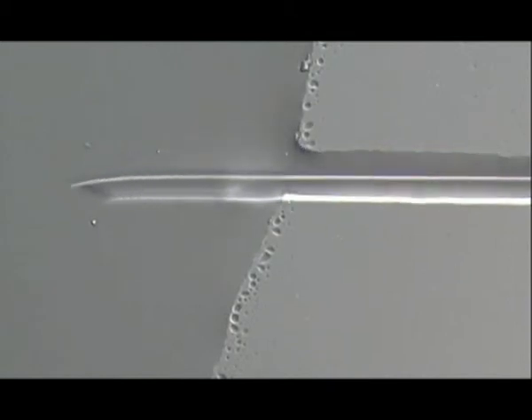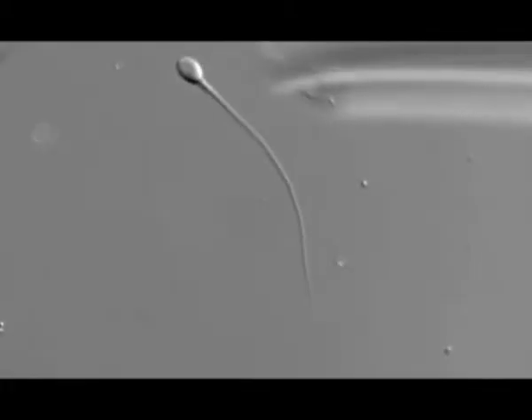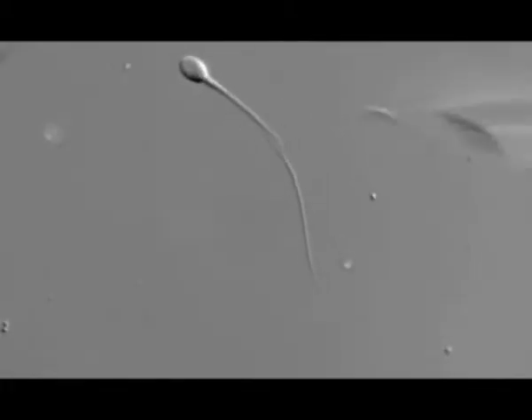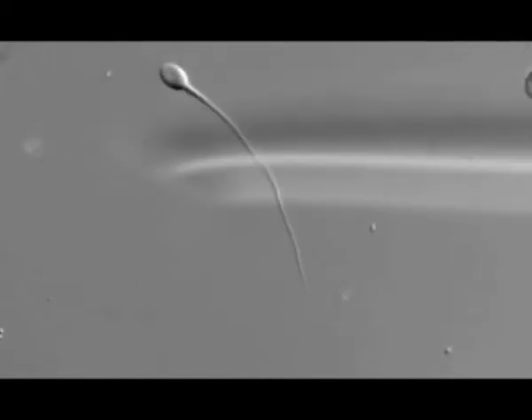Lower the ICSI pipette into the clean SpermSlow drop and aspirate 5 to 6 mm of SpermSlow into the pipette. Look for a bound sperm with good morphology, moving tail and without any forward motility.